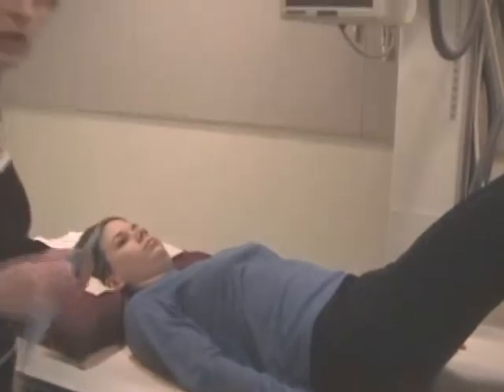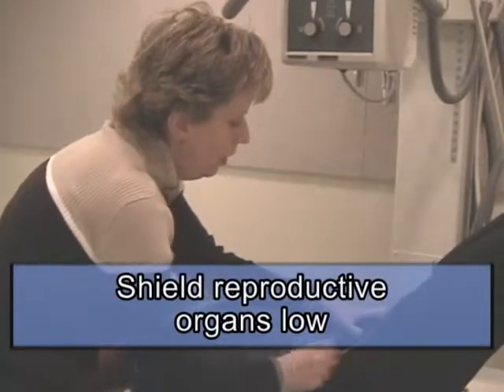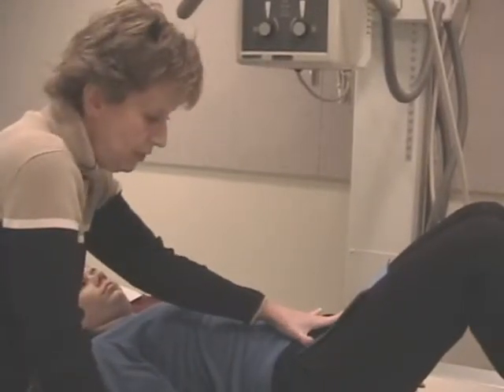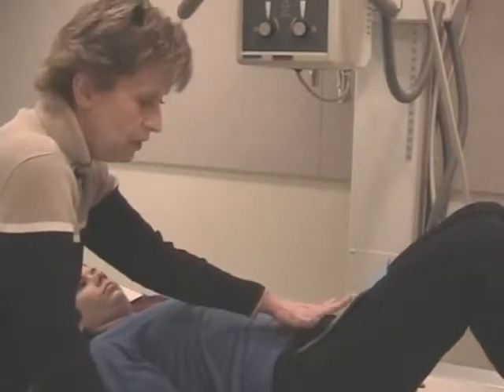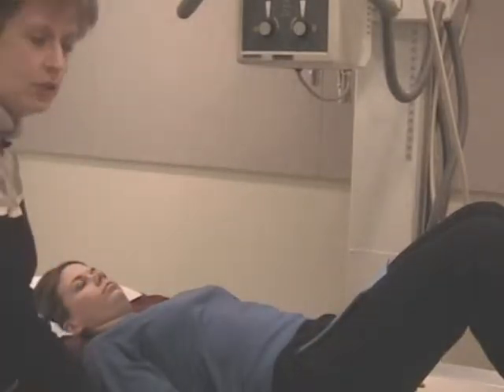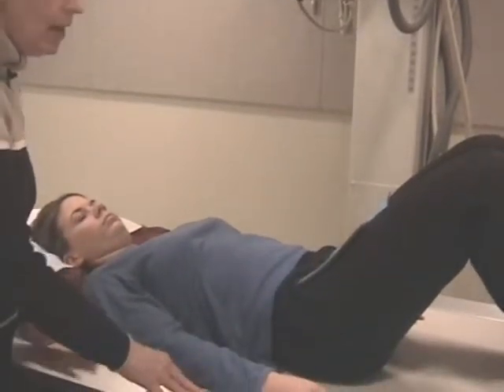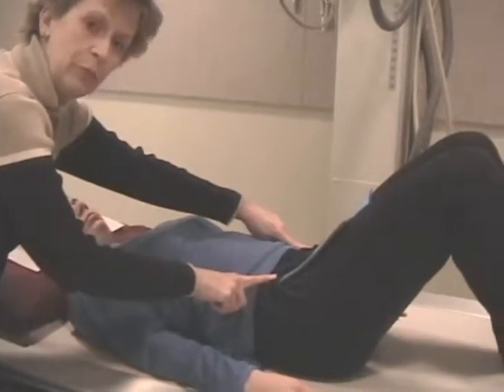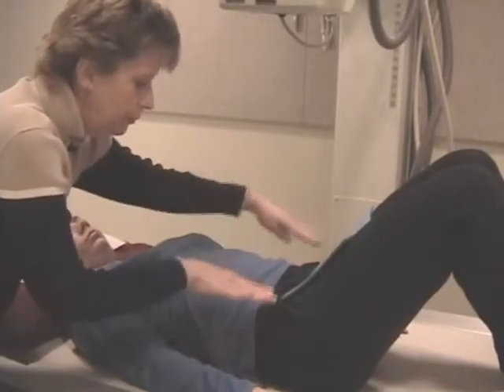If you shield your patient's reproductive organs, you need to shield very low. Most of our clinical sites like to include some of the sacrum. So we have to position the lead shield low, barely covering the ovaries. We're definitely covering the scrotum there. Okay, so again, my patient is straight, their knees are bent, both arms down or both arms up, and the body is not rotated. Actually look at the anterior superior iliac spines, and they should be equal distance to the table.